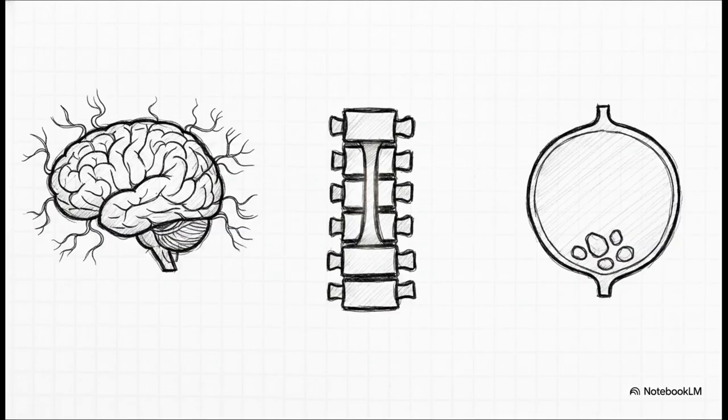We can literally map out the entire vascular system, even the cerebral vessels in the brain, using angiography. We can outline the spinal cord subarachnoid space to pinpoint disc lesions through myelography, or we can perform cystography, injecting both iodine and air directly into the bladder to reveal radiolucent stones. The diagnostic power we have here is just staggering.